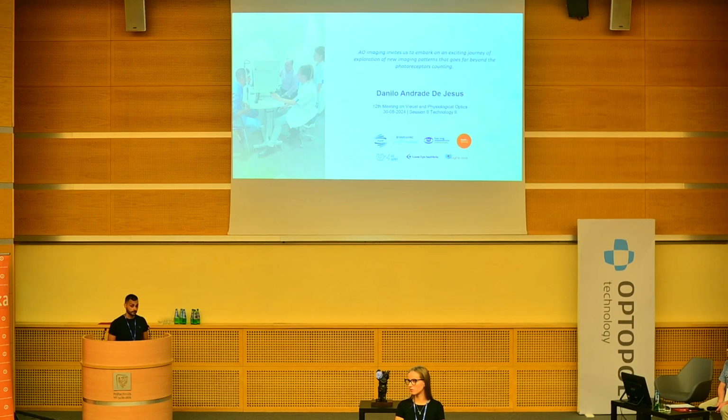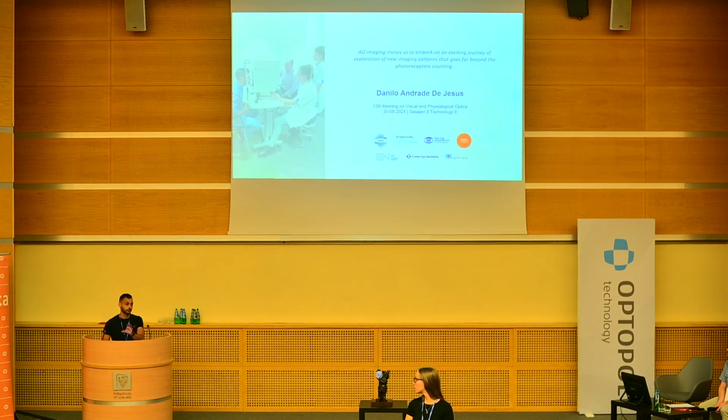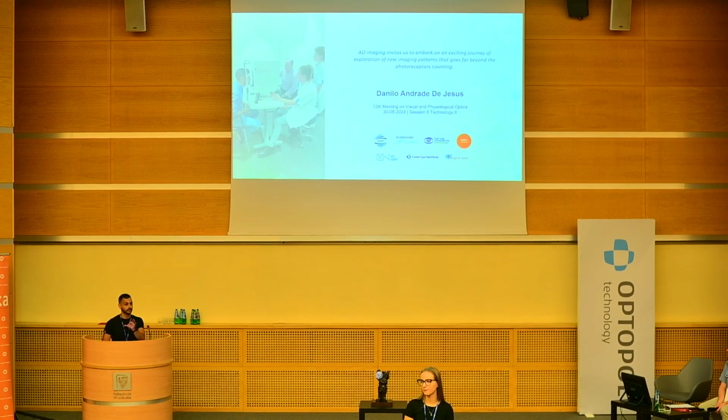Sure, definitely. So cataract, for instance, is an issue, but it's also an issue on fundus imaging normally. Usually you should use RTX1 when you are able to acquire nice images with OCT or fundus images. If you are not able to acquire nice images with those, you shouldn't be using the RTX. And actually, I would say that the advantage of this technology is for the early detection of diseases. It has a lot of potential in diseases like retinitis pigmentosa, Stargardt, where you don't see any changes in the photoreceptors layer in OCT, but you can already see a decrease in the cell density.